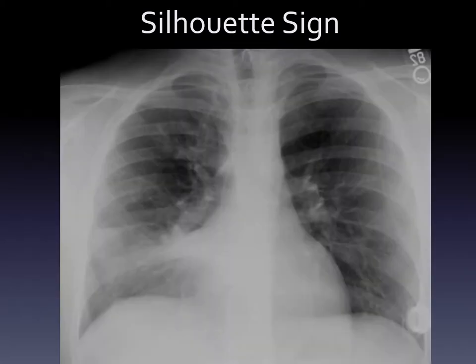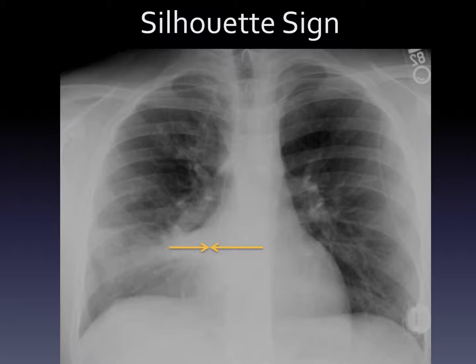This concept — the silhouette sign, where we lose that edge — is discussed in pneumonias pretty frequently. Notice here, we have increased opacity, increased whiteness, in the bottom of the right lung. We can't actually see the edge of it near the heart, and that is because this opacity, which is a pneumonia, has the same density as the heart — meaning they're touching.